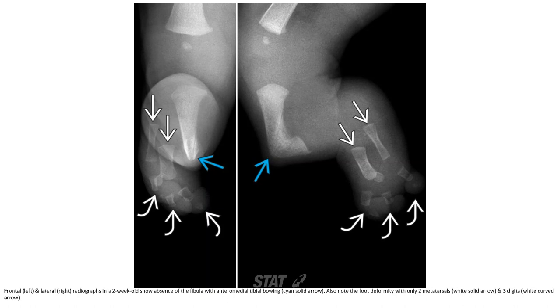This is a frontal and lateral radiograph in a two-week-old showing absence of the fibula with anterior-medial tibial bowing. Also note the foot deformity with only 2 metatarsals and 3 digits.